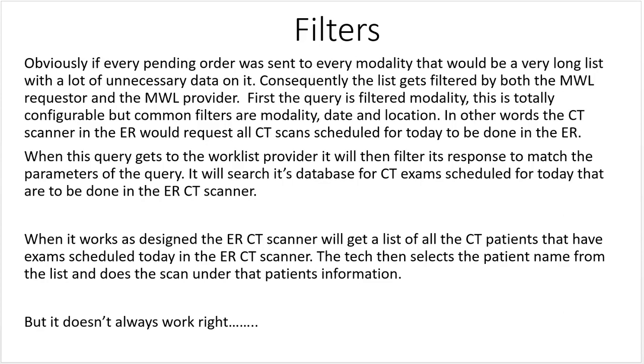Obviously, if every pending order was sent to every modality, that would be a very long list with a lot of unnecessary data in it. So you can imagine if you are the CT tech and you've got CT orders, ultrasound orders, MRI orders, nuke med orders, you'd have to filter through all of those. So it would be nice if at the ultrasound cart you only got the ultrasound orders. So consequently, the list gets filtered by both the modality worklist requester and the modality worklist provider.